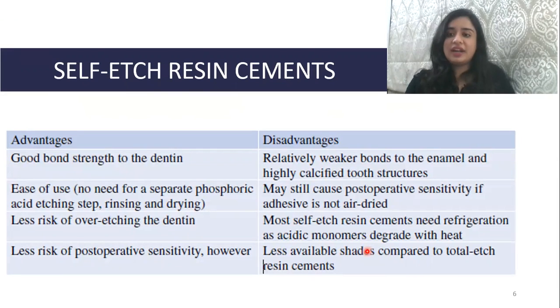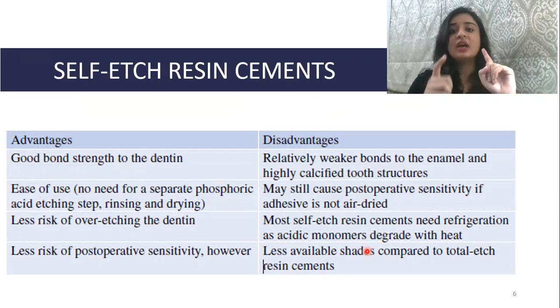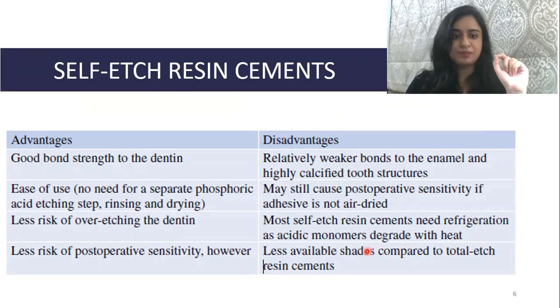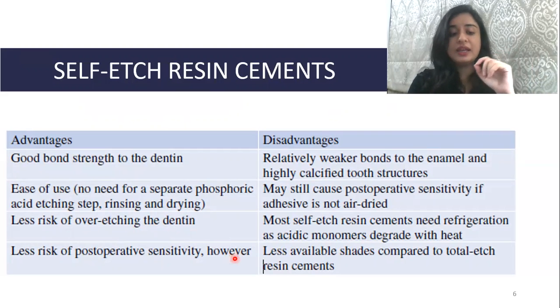Now, coming on to the advantages again here, it has good bond strength to dentin. See, whenever we are discussing etch and rinse, please apply this to bonding agents and resin cements. That is, it has good strength to enamel. But when we are talking about dentin, good bond strength is achieved with self-etch resin cements. Ease of use, as there is no need for a separate phosphoric acid etching step. Then there is less risk of over-etching the dentin, and less risk of post-operative sensitivity.